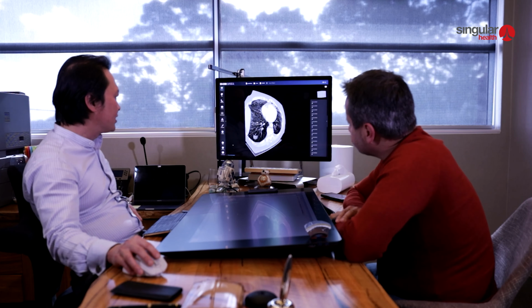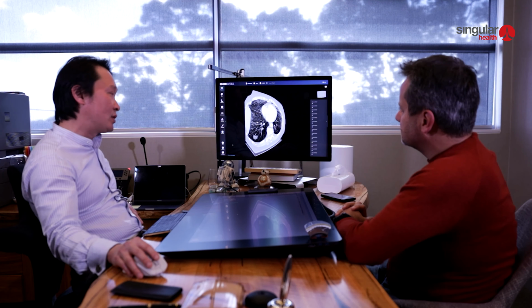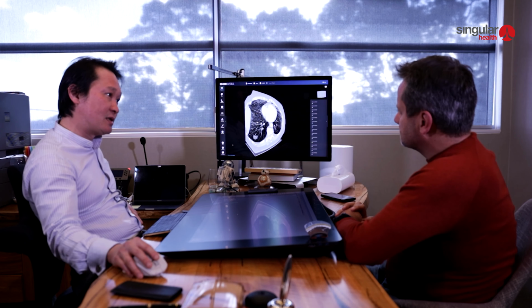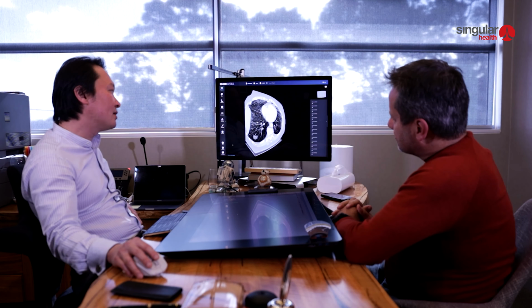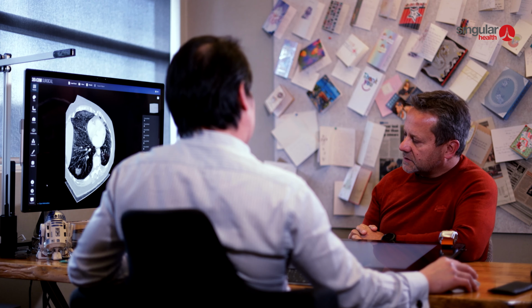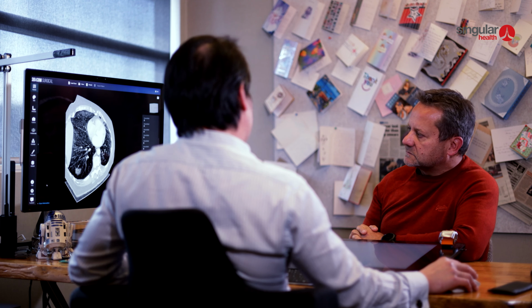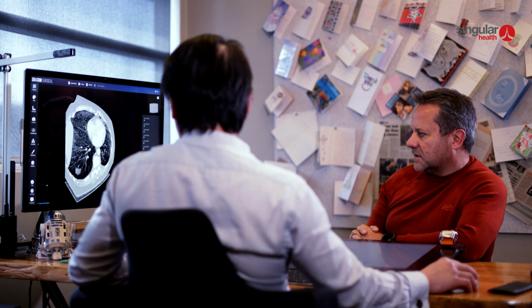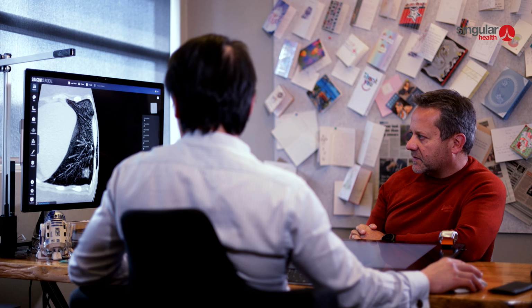Then they'll send it off to histology, and it'll take about 2 weeks, and then we'll have a result to see what type of tumor it is, whether it's malignant or benign. Then we will know what type of treatment to embark upon, whether that be surgery, radiation, or chemotherapy. I understand.